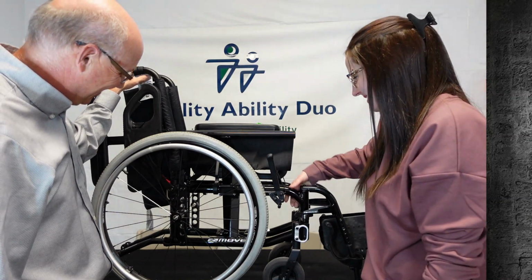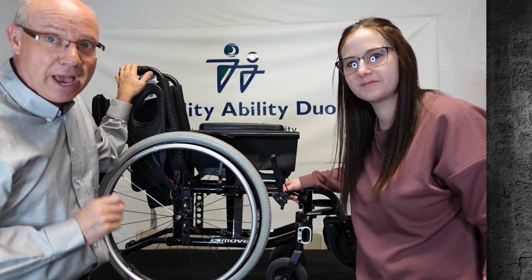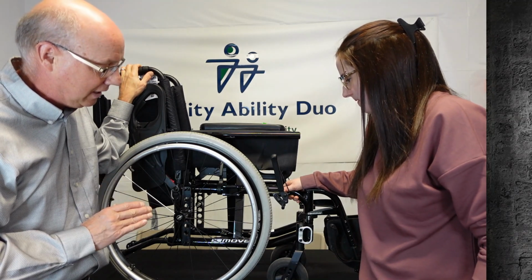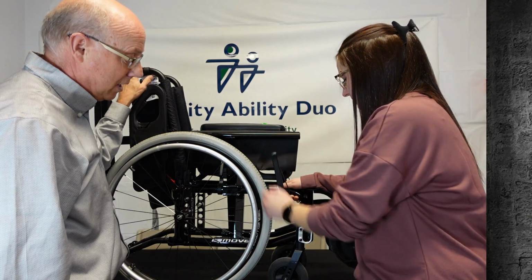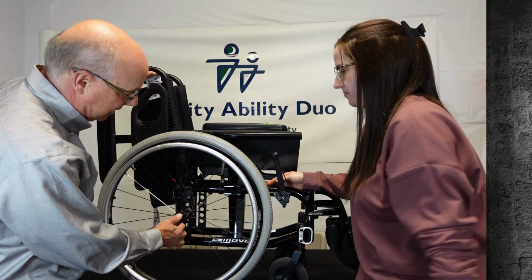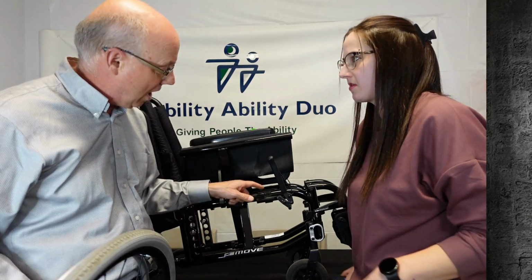That's how we roll. That is how you adjust a manual wheelchair's brakes. You do have to make sure you have the right Allen keys, and you have to make sure the brake is sitting straight. Once you know that you're perfect here, the last thing we'll do is tighten it up so it's really tight, so it doesn't spin on that round shaft.